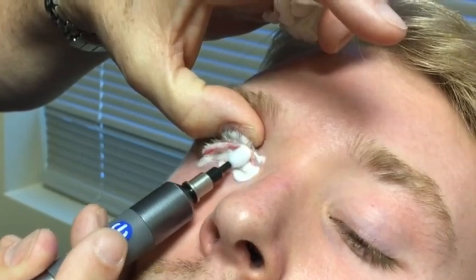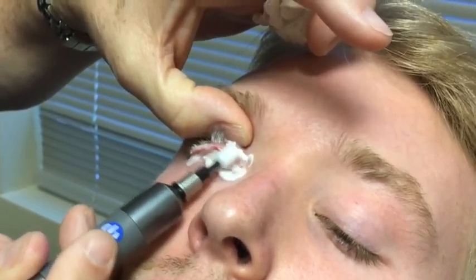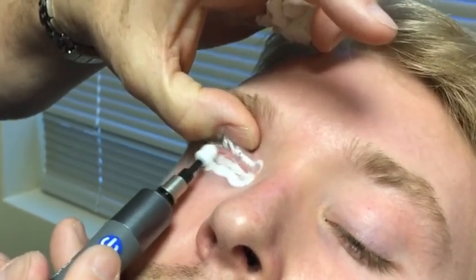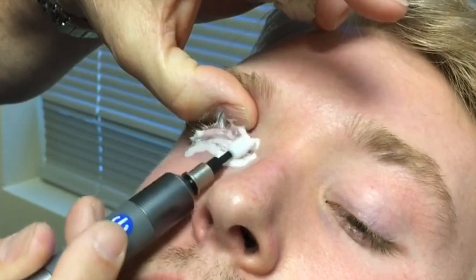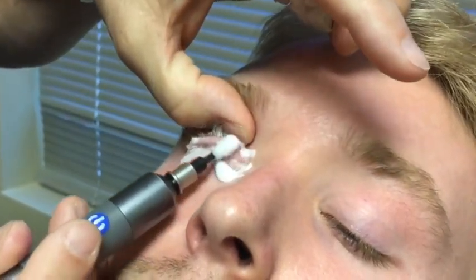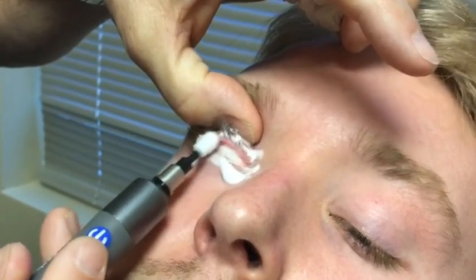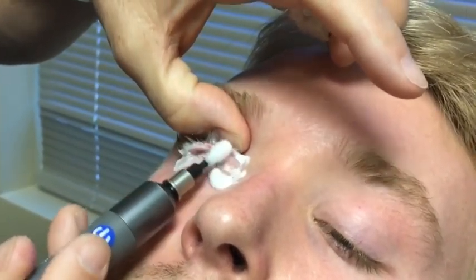If you pop inside sometimes, it doesn't hurt a thing. And these patients will have a little bit of laxity to their lids. So don't be surprised if you pop in on the palpebral conjunctiva sometimes. They've had years of chronic inflammation, so the lid can be very lax sometimes. And maintain that steady pressure in once you've rolled down. So it's a roll down and push in.